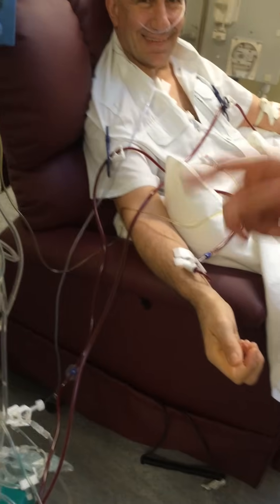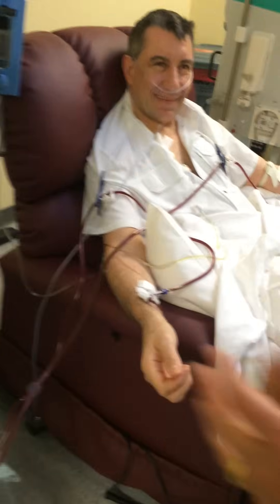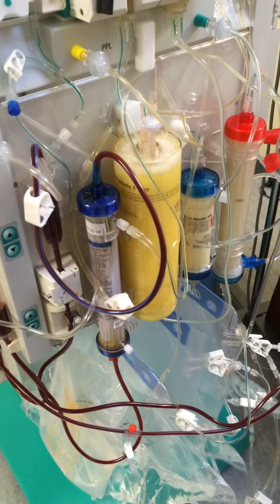All of this is happening very rapidly, but that's the full process explained in slow motion.